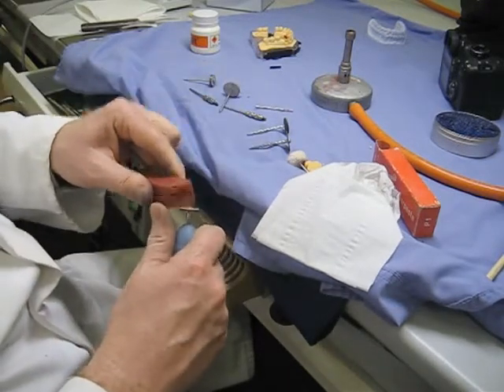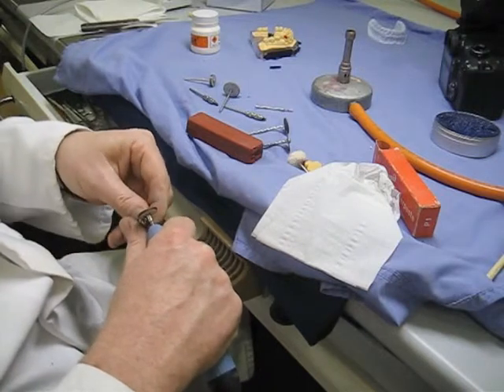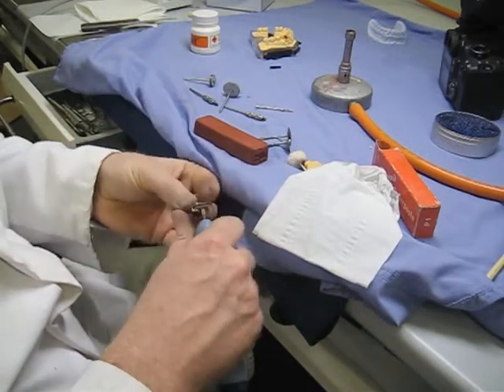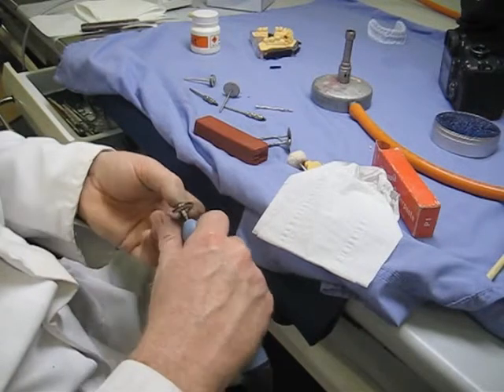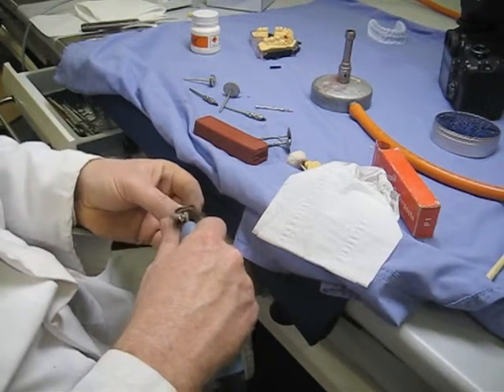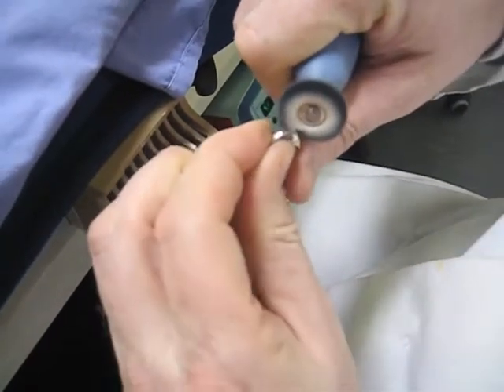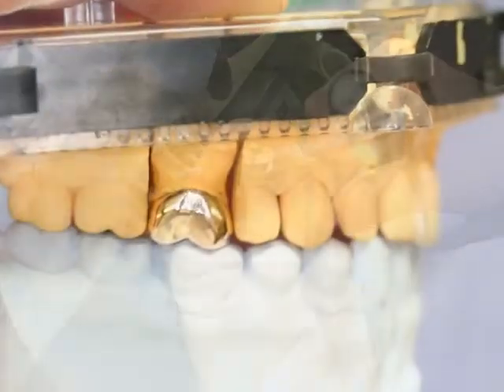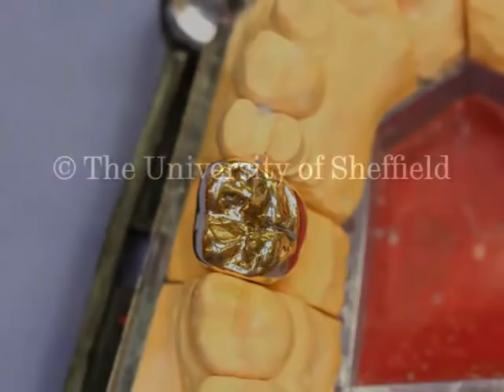Once we've been all the way around the restoration with the green abrasive, we move on to a brush with some jeweler's rouge polish — the same thing jewelers use when polishing a ring. It's basically a lump of wax with very fine grit, and you can do the occlusal surface nicely with it. The very last thing is to buff the surface up with a cotton mop. Be careful not to grab the crown with the mop and launch it across the room. And there we go — one finished crown, cleansed surface, job done.